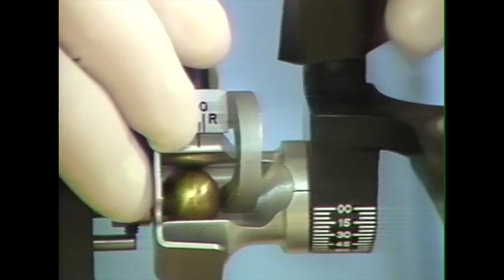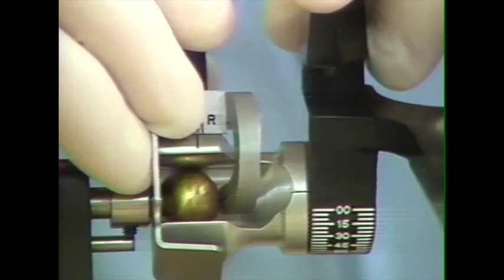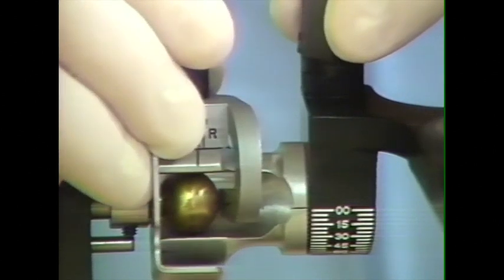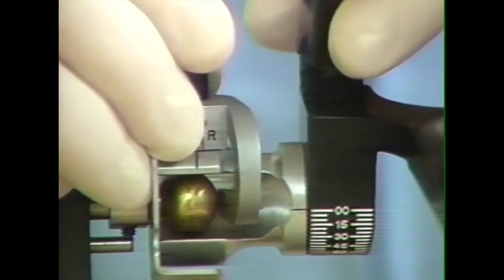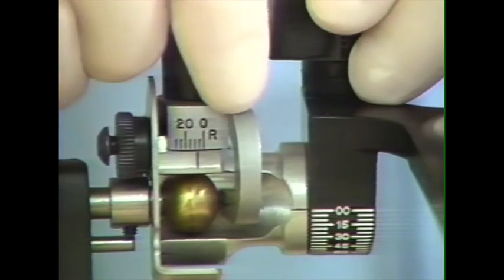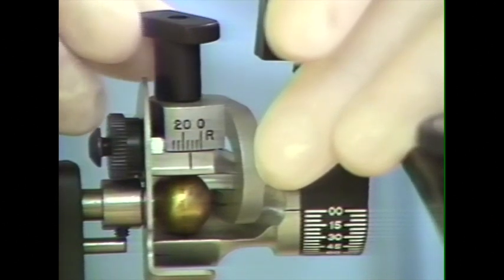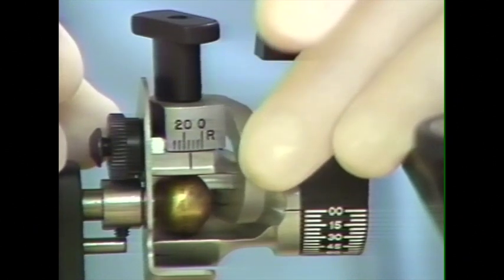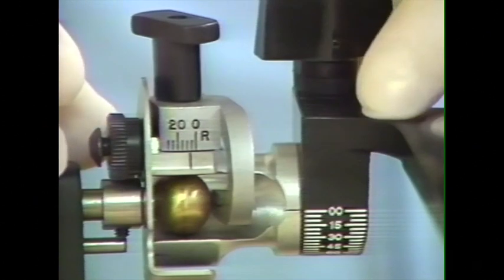The modular articulator has adjustable condylar elements. The condylar inclination can be set by loosening the knob on the top, and raising and lowering the inclination to accept the record. It also has an adjustable Bennett angle, which is adjusted by loosening the other large set screw and moving the inner curbing of the condylar element inward and outward according to the record that's placed into the articulator.